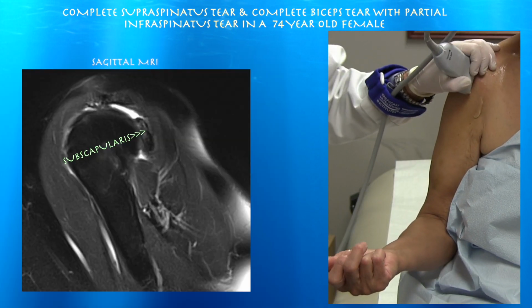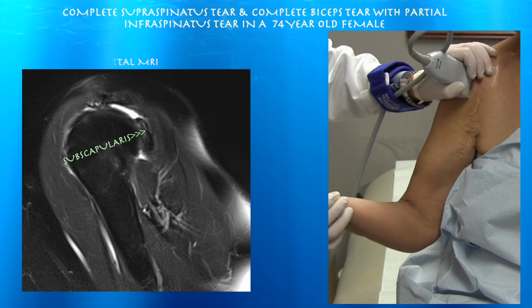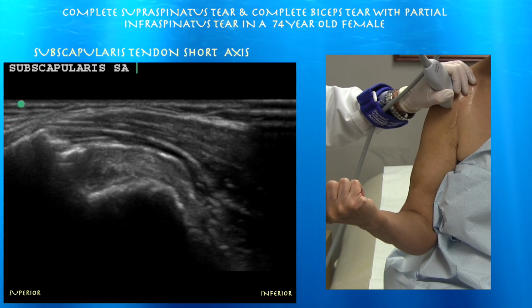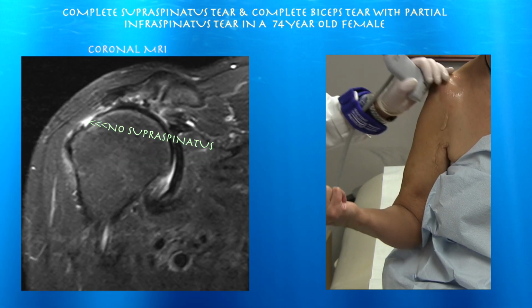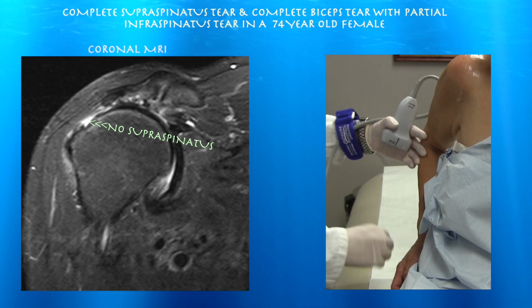Okay, now we're going to do a short axis view of the subscap tendon. Just really keep that arm out like that, yeah. Right side of the screen is inferior. You can actually see some fairly decent fibers here. Okay, now we're going to look at our supraspinatus tendon. This is our most important view. This is the tendon that I believe is completely torn.